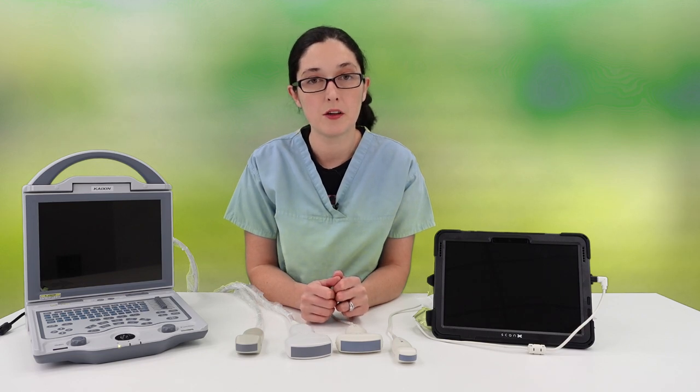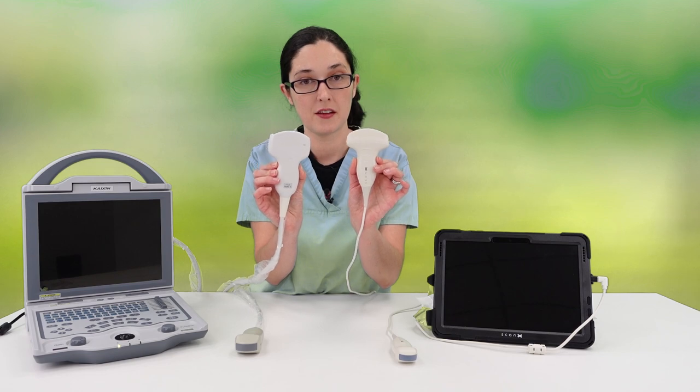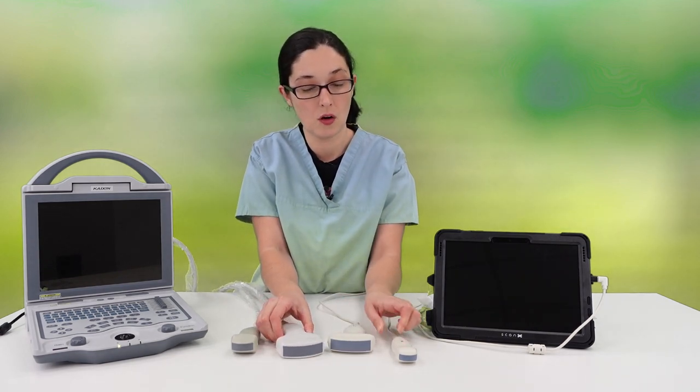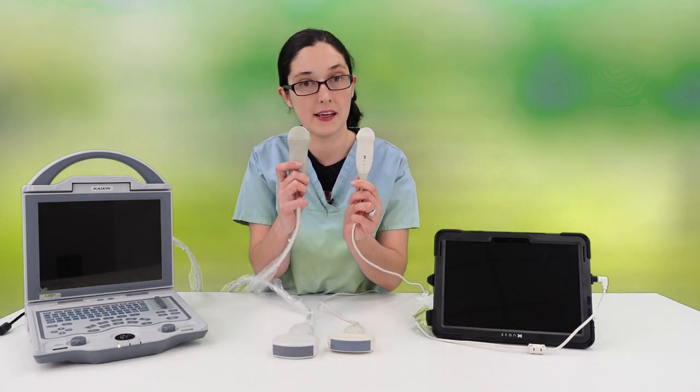The most common probes for goat pregnancy scanning are convex probes, which are lower frequency and larger, or the smaller higher frequency microconvex probes.